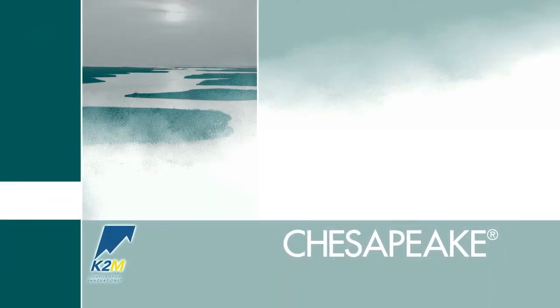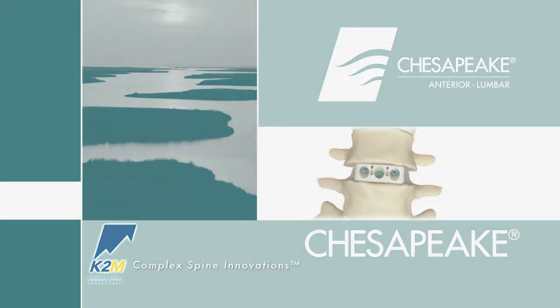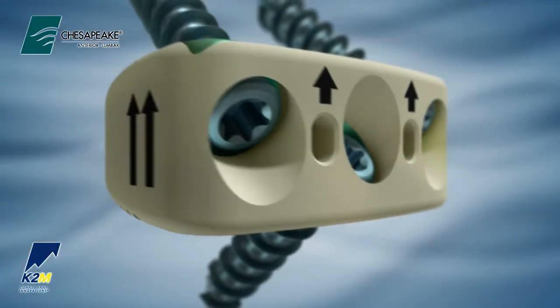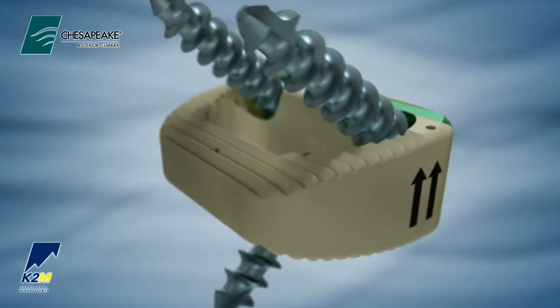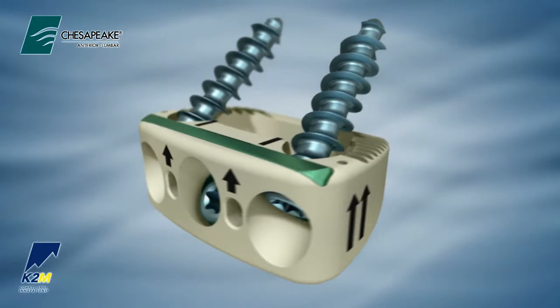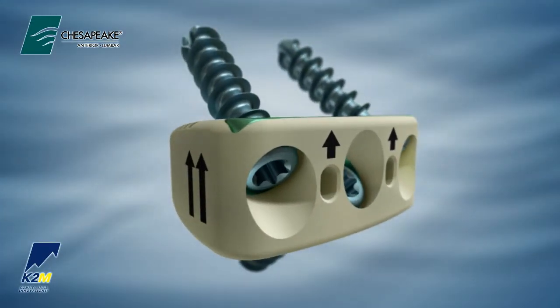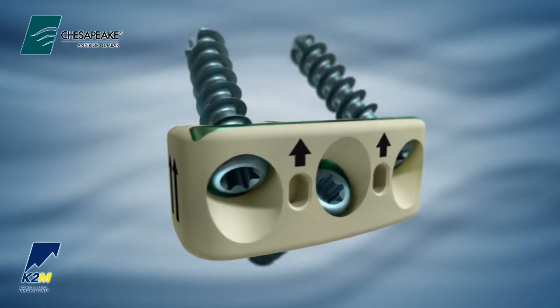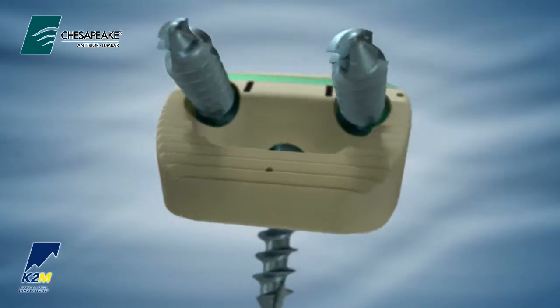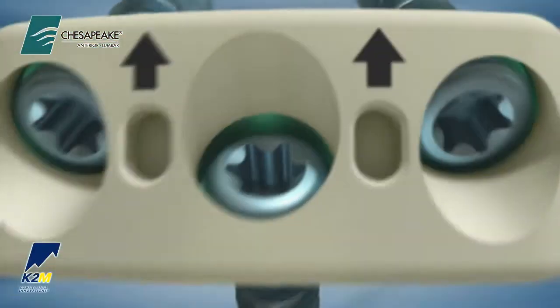Introducing the Chesapeake Anterior Lumbar Stabilization System from K2M. Complex Spine Innovation. Chesapeake is a multi-screw construct, providing stability to the anterior column while reducing the need for supplemental fixation in the lumbar spine. Featuring the revolutionary Tyfix locking technology, the system exemplifies advances in new and innovative instrumentation and technology required to achieve fusion.